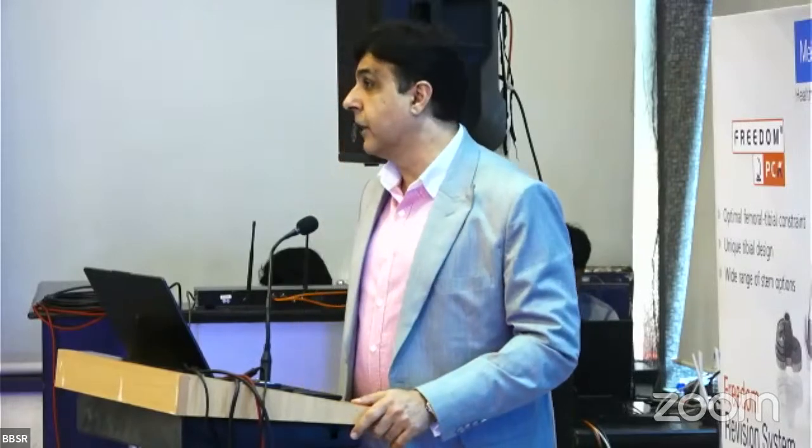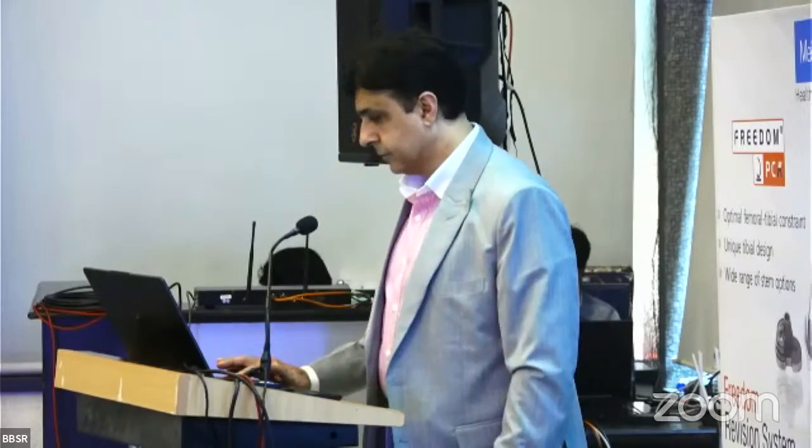This was the picture that we saw inside. You look at the insert out there, totally worn through. Now this time the femur was rubbing on the tibia, and when you have different metals rubbing on each other, you have metallosis and pictures like this. This is very common when we see patients coming with a very, very late presentation for revision. And because of this osteolysis, what you had is a huge amount of bone loss on the femur and the tibia, and the osteolytic patella.